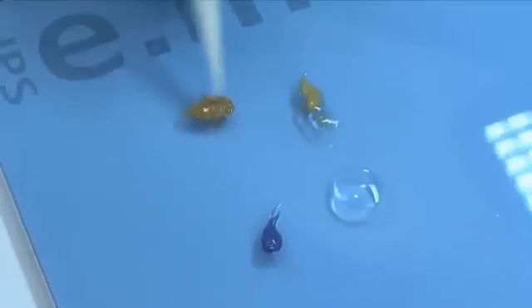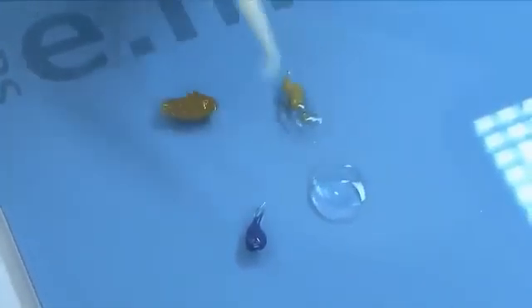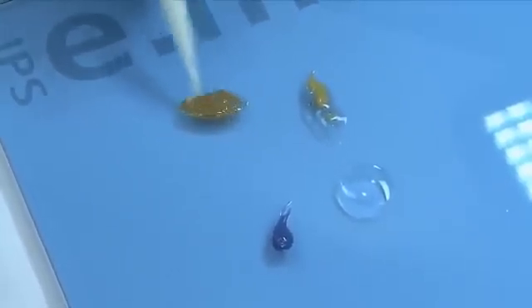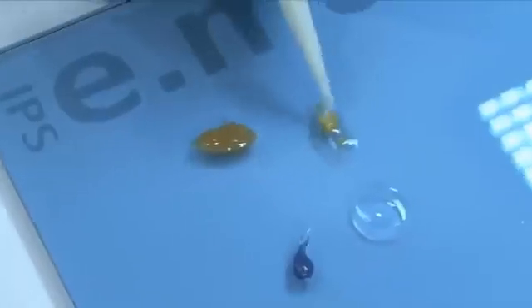Extrude small amounts of the needed shades and stains onto a mixing pad and mix thoroughly. Add a small amount of glaze liquid as necessary until the shades and stains are at a workable consistency.